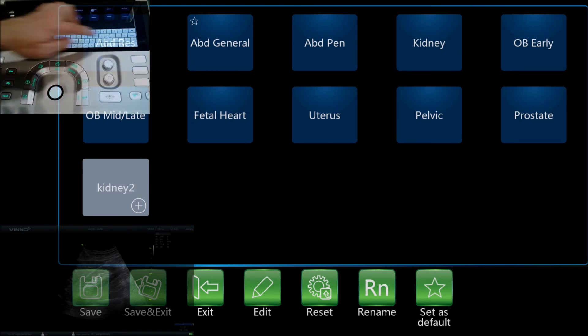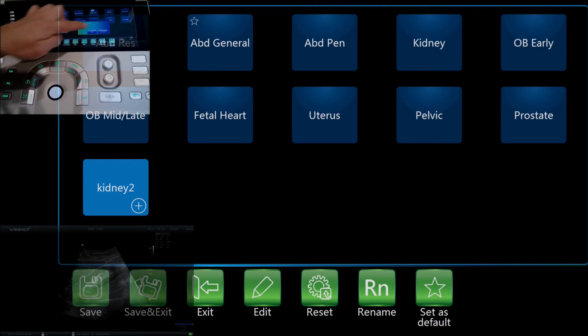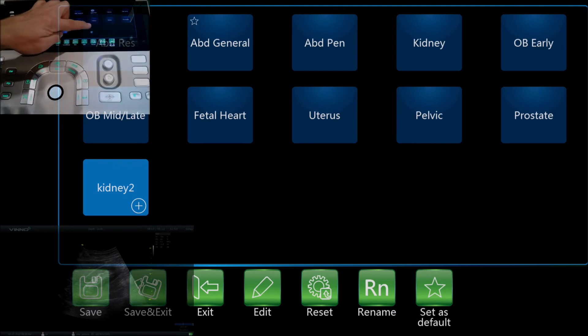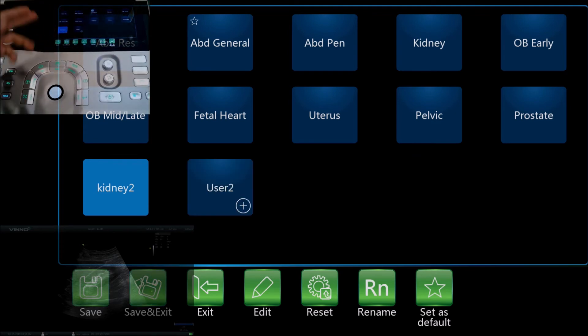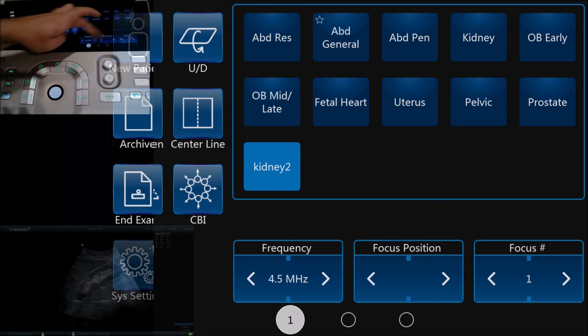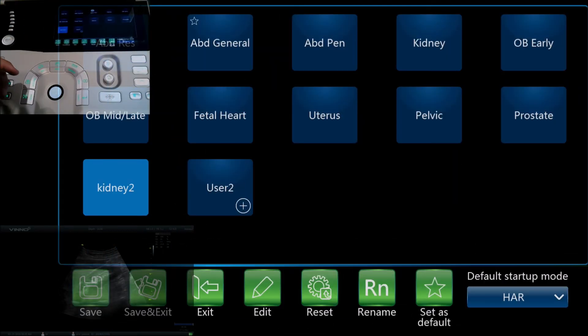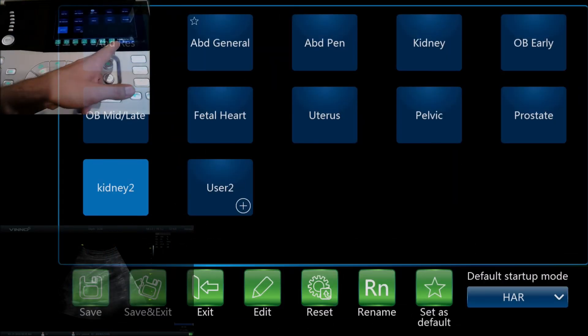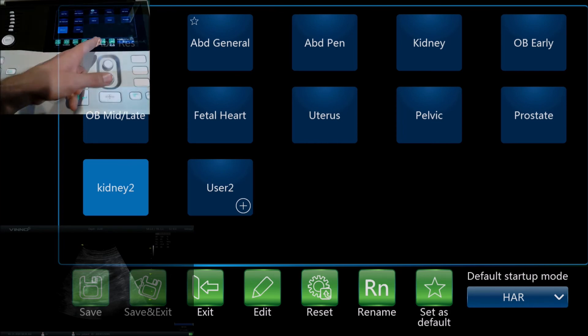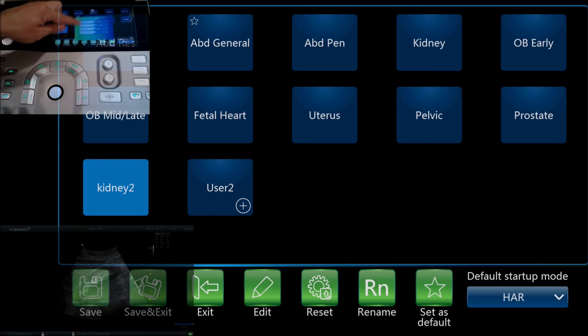Then we'll just hit save and save and exit. If you ever need to, you can also in the probe and app menu set something as a default or reset to the factory settings. So if you hit reset here, we can reset all of the factory applications and settings.